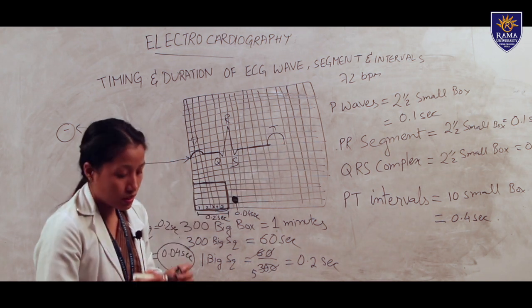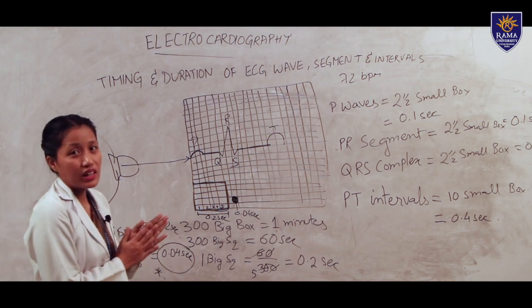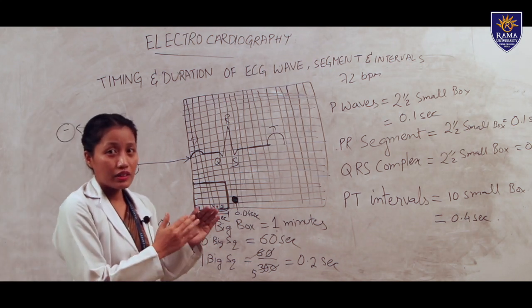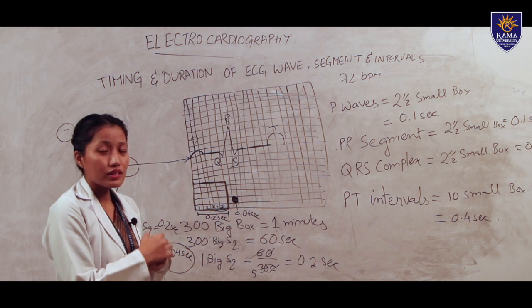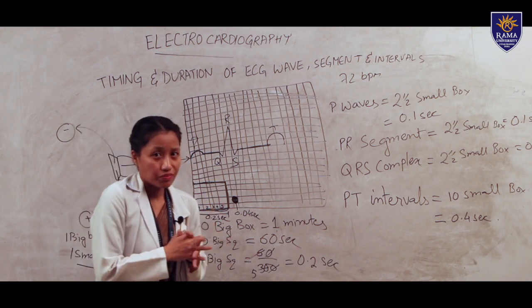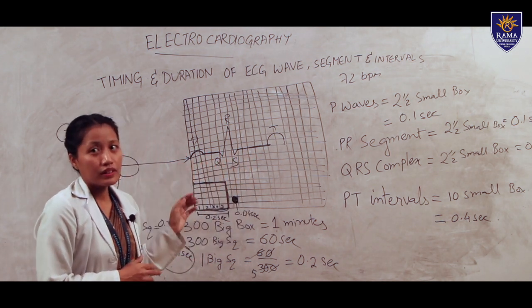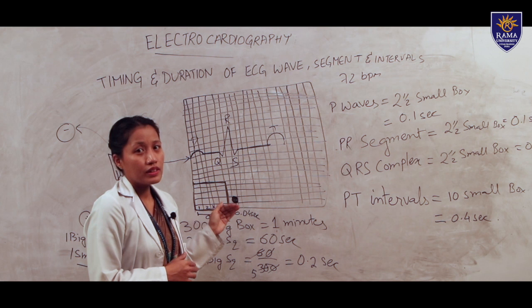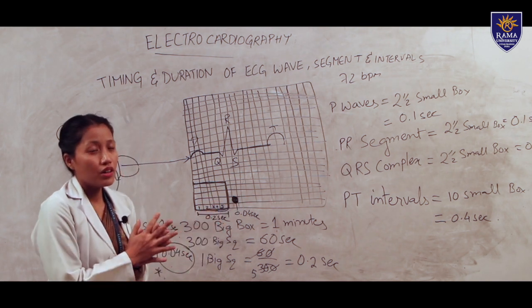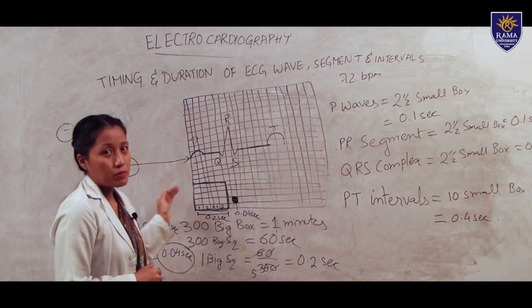So now we will revise the topics. ECG is nothing but the electrical activity of the heart, graphically presented. That is known as ECG. In the ECG mainly 12 leads are there. There are 3 standard limb leads, 3 augmented leads and 6 chest leads or precordial leads. These are the 12 leads, and we have already seen the placement of the ECG.